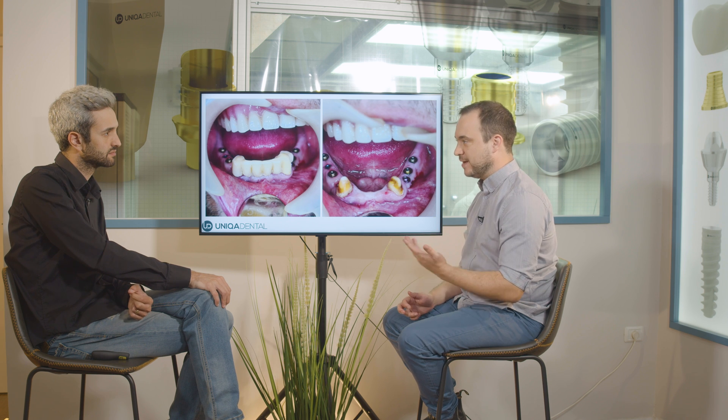About two or three weeks after the implantation process, the bone starts to resorb and the remodeling of the bone begins. This is the most crucial part of the osteointegration — the fixation of the implant in the bone is most fragile. So either you load the implants right away — immediate loading — or you wait until you have full osteointegration. You don't have anything in the middle.